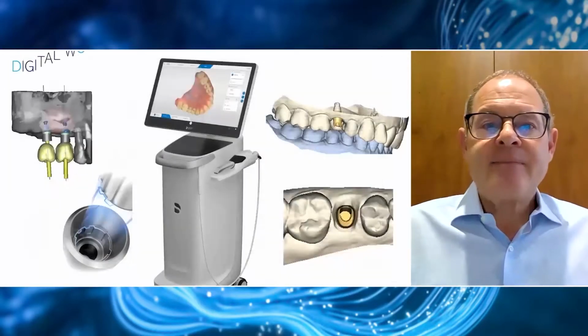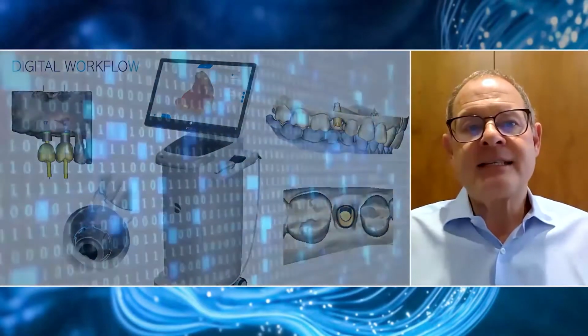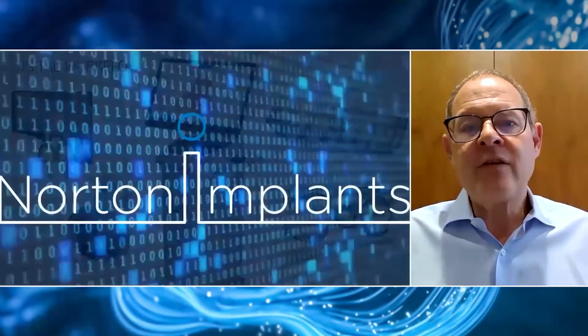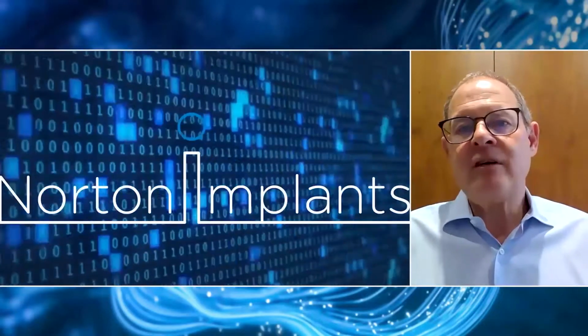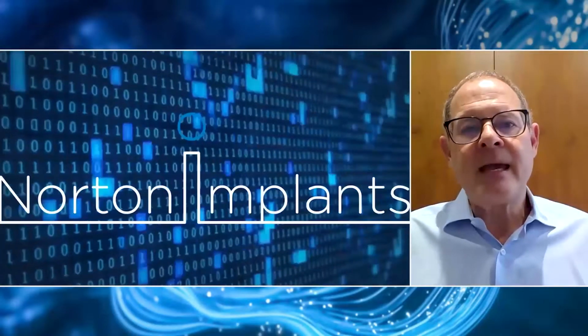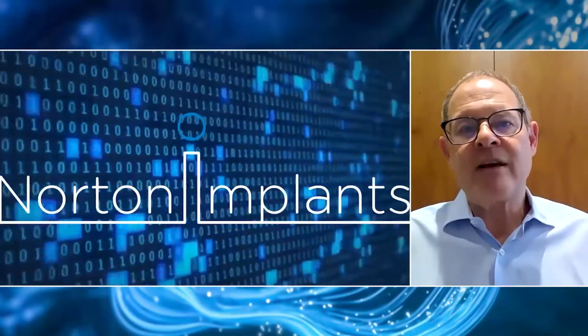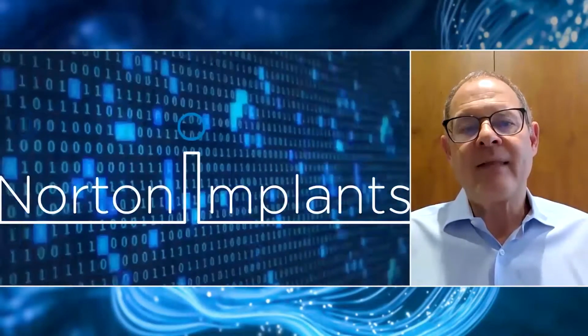That all said, I want to finish where I started and say to you that after 30 years of doing implant dentistry, I'm in absolutely no doubt that this digital workflow is delivering for me the finest implant-supported restorations that I've been able to provide my patients throughout that time.